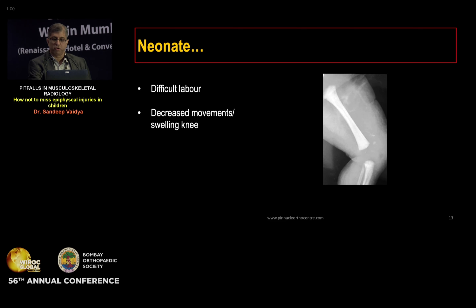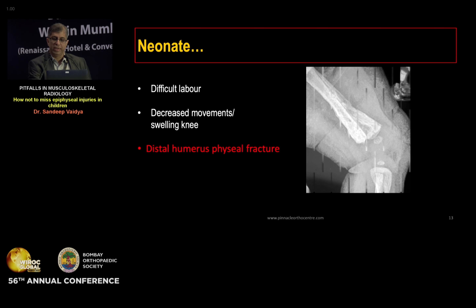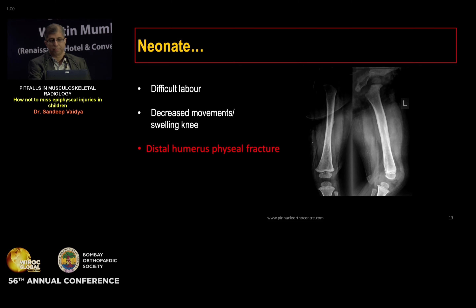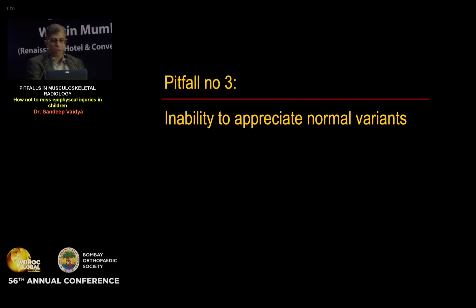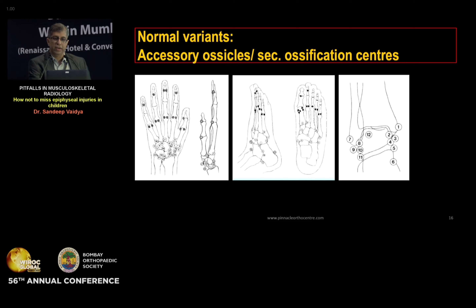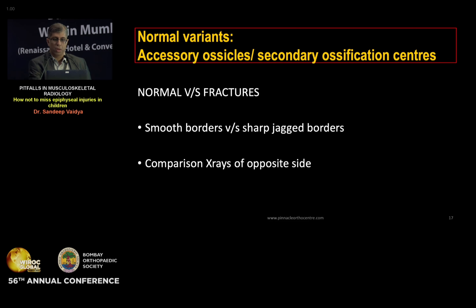A similar case involves the knee joint: swelling and restriction of movements in a neonate with a normal-appearing X-ray. However, looking carefully there is a bony flake anteriorly — this is actually the entire distal femoral epiphysis — a distal femoral physeal fracture. As seen on subsequent X-rays, this heals, consolidates, and finally remodels. Rule number two: when assessing plain X-rays in a child, visualize the bones present but also imagine the cartilage that is not seen.